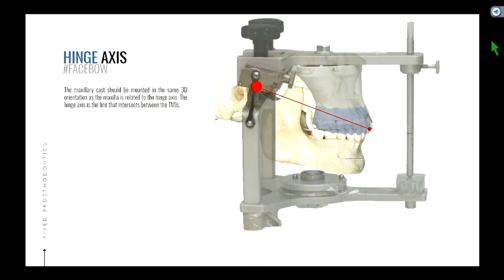To mimic rotation on the articulator, you lift the top member up. It's a little bit opposite in the sense that it's our lower jaw that moves in real life, but when you simulate it on the articulator, you move the upper member. Another way is to hold the upper still and move the lower — that's more like what your jaw does. The easier way is just to have it on a table and open it. Same motion.